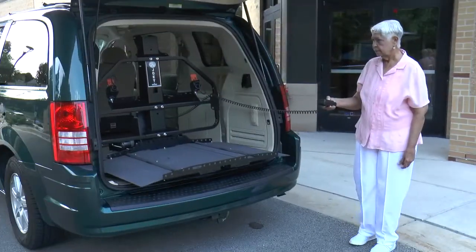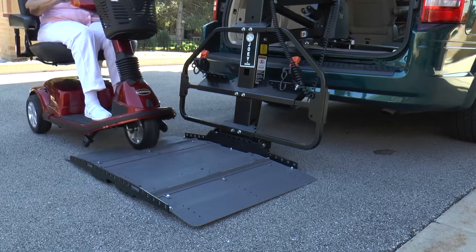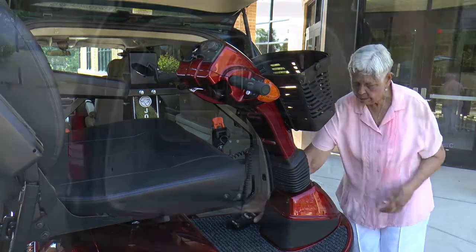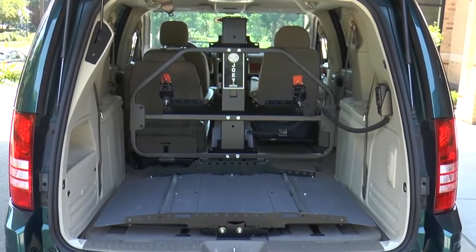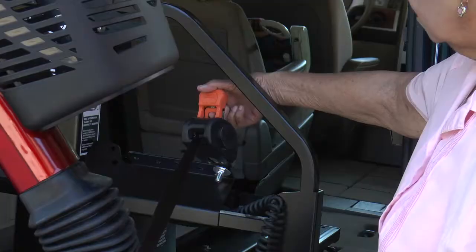Simply push the button and the fully powered lift lowers and self-levels. Ride a scooter or power chair onto the platform until the wheels catch in place, raise the lift to a comfortable height, and secure the mobility device. Most people use the Joey's optional safety barrier, which features two easy-to-use belts to ensure the mobility device is secured.